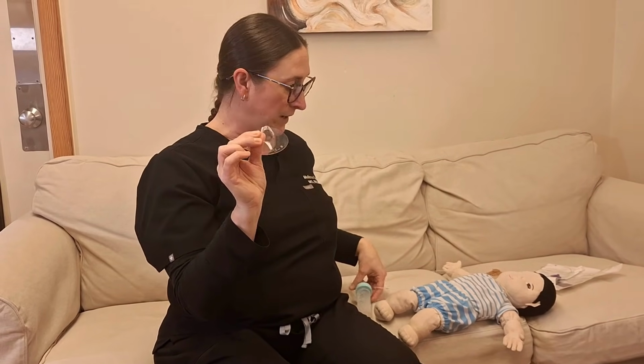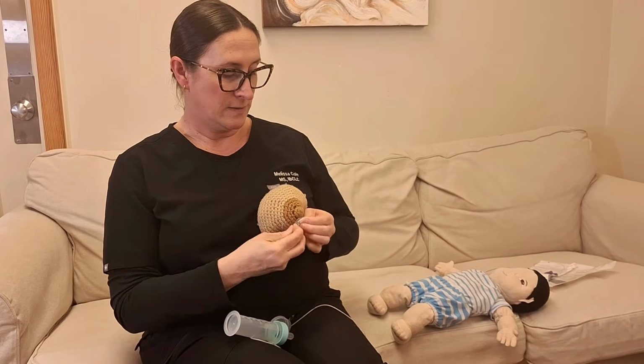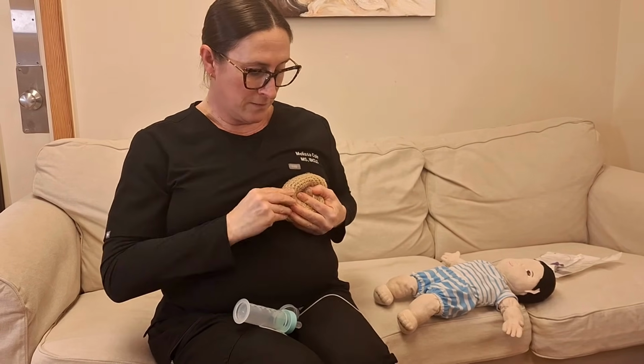So for a baby that is requiring the assistance or is used to a nipple shield for feeding, what I would encourage a parent to do is make sure it's the right size and shape for you. Get your nipple shield on well.